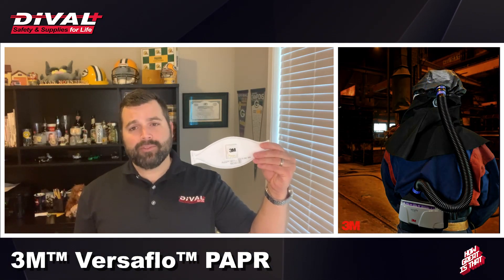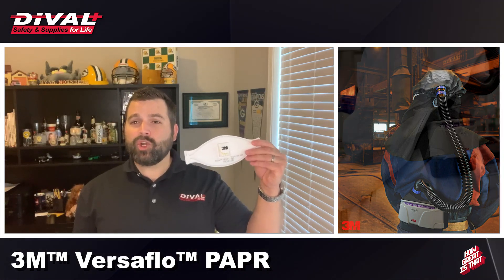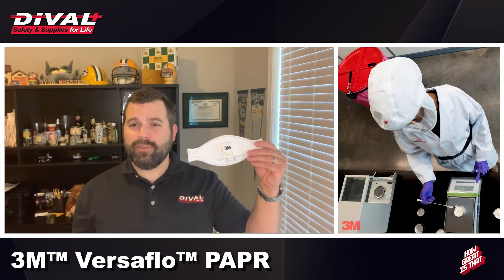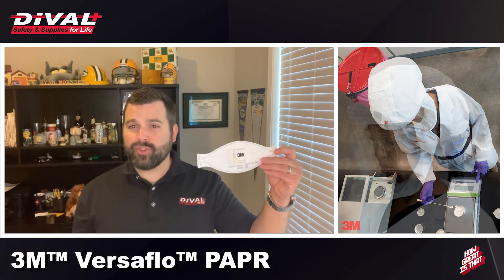For those needing higher levels of protection, greater levels of comfort, increased levels of compatibility with other portions of their PPE, as well as greater flexibility in terms of who can use the PPE, there are far better solutions.